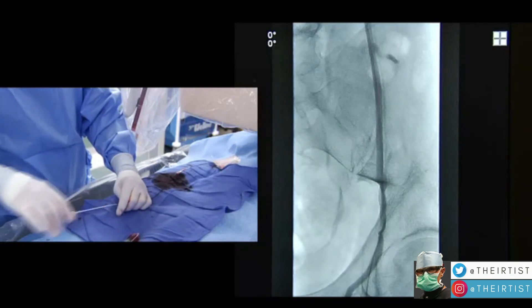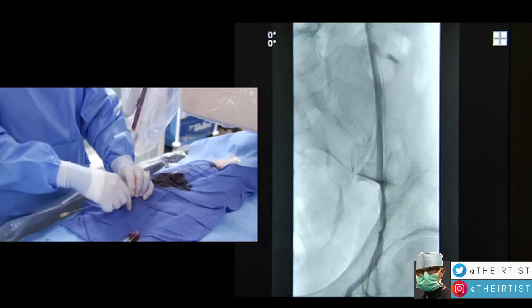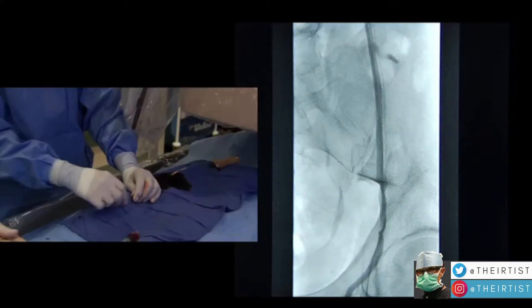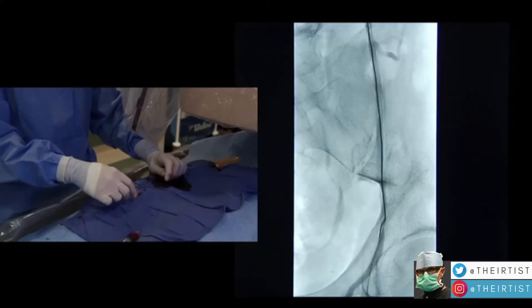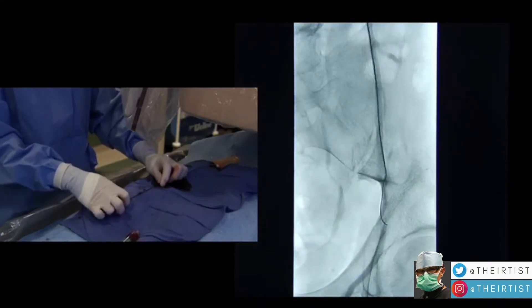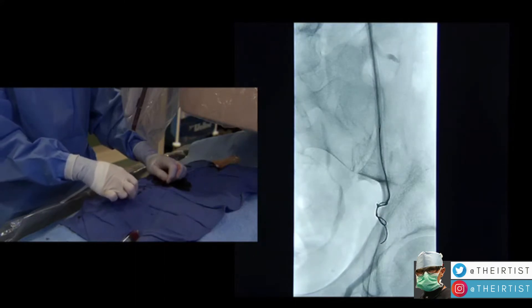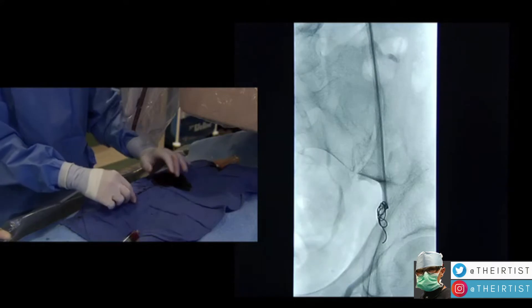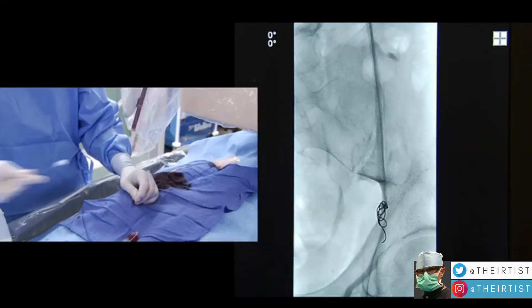These are called pushable coils — they are pushed by a guide wire and once in position begin forming a coil shape. A coil is a type of material that induces thrombosis, meaning blood coagulation inside the vein, as well as some local inflammation. Ultimately, this leads to creation of a thrombus and a local inflammatory reaction that blocks and closes the blood vessel.